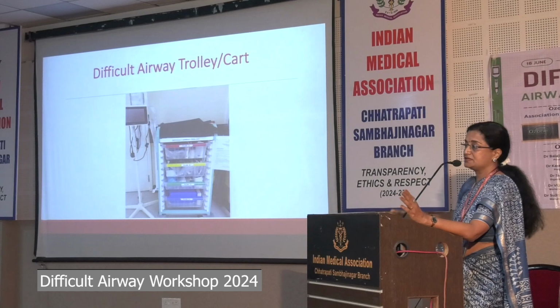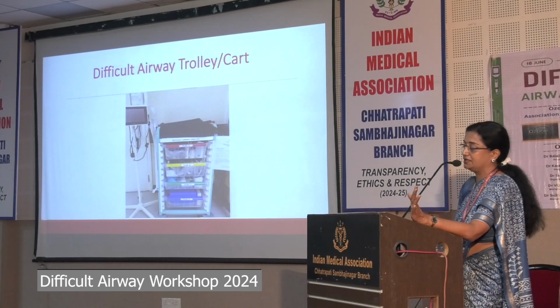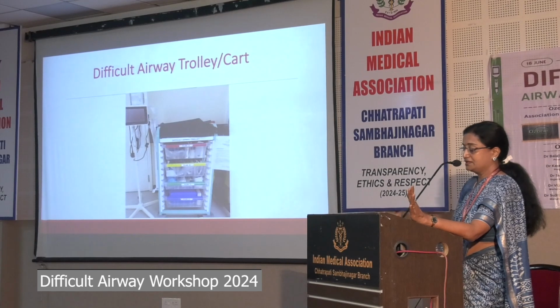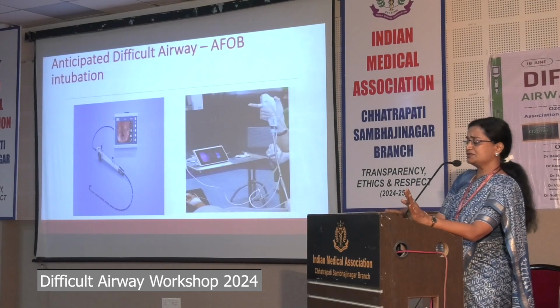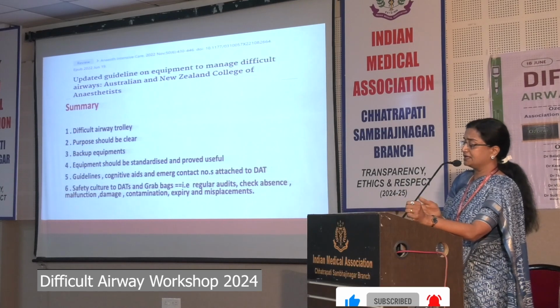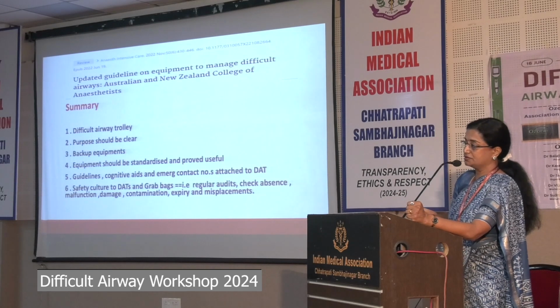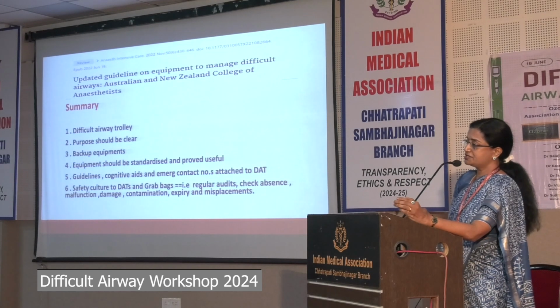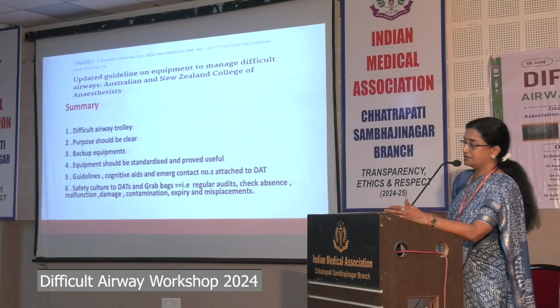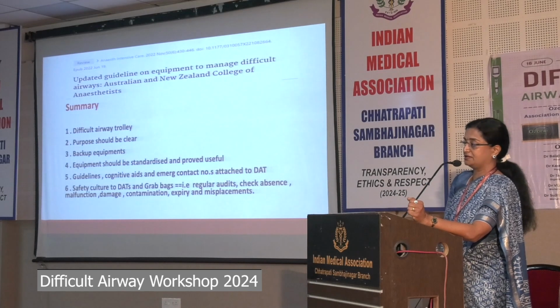First and foremost, a simple request to all of you here: go back and have your difficult airway trolley cart ready. Make it for anticipated cases, and of course have a fiber optic bronchoscope. This is an updated guideline on equipment; the guidelines came in 2012 and were updated in 2022. Right from the first lecture, we are saying keep a difficult airway trolley ready. Equipment should be stored in the difficult airway trolley.